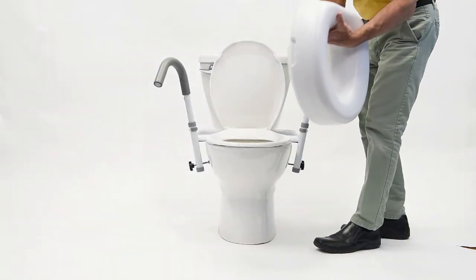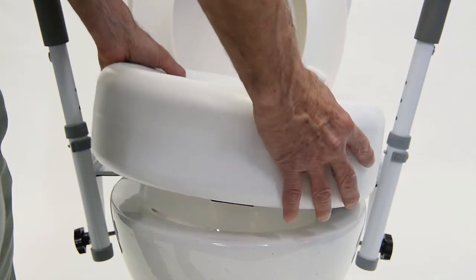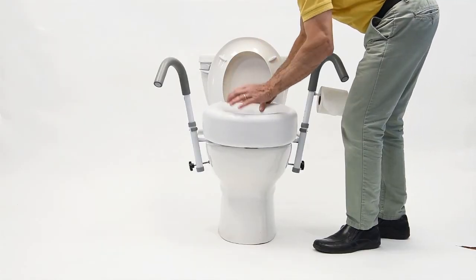The Ultra Frame makes it easy to use a raised toilet seat in conjunction with other features. Simply raise both toilet seat and lid and install the raised toilet seat.